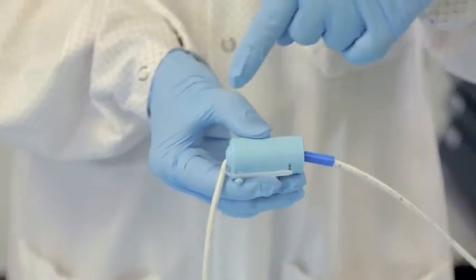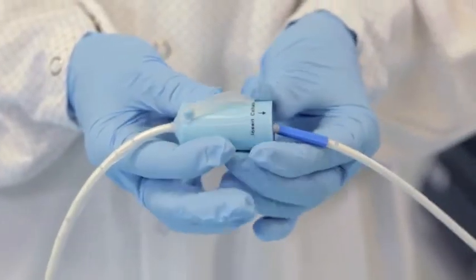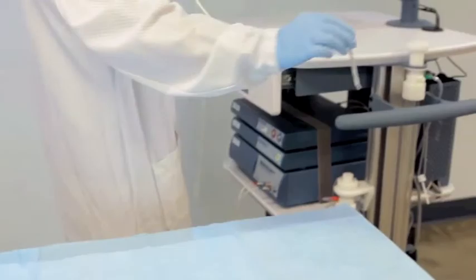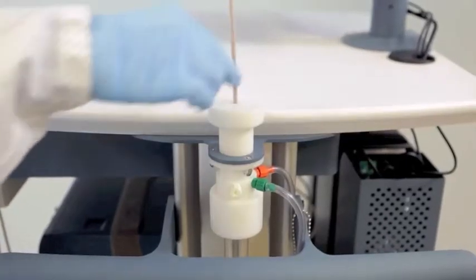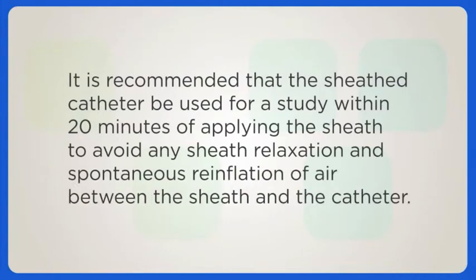If the tab is not secured against the base of the slider, it may cause the catheter to bend. You are now ready to pressure calibrate the catheter and then intubate the patient and perform the procedure. It is recommended to use the catheter within 20 minutes of applying the sheath to avoid any sheath relaxation and spontaneous reinflation of air between the sheath and the catheter.